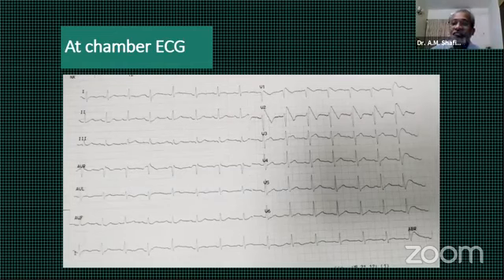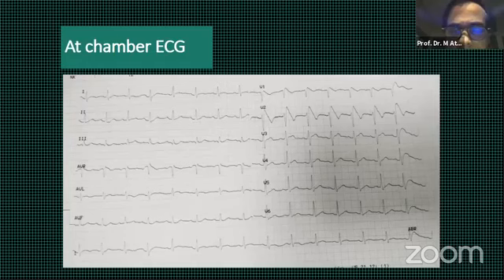Right. Hafiz bhai. Hello, Hafiz bhai. In all the ECG textbooks, the shape of the ST segment in this ECG, what is highlighted in V2, is always stressed there. What should be the shape of the ST segment in case of Brugada syndrome? And seeing this shape, I think it is very difficult to compare this ECG with the ST segment of ST elevated myocardial infarction. I totally agree with you.